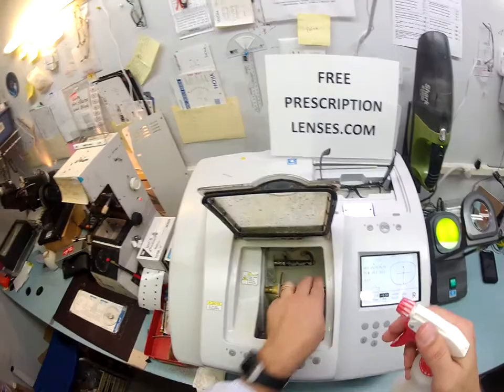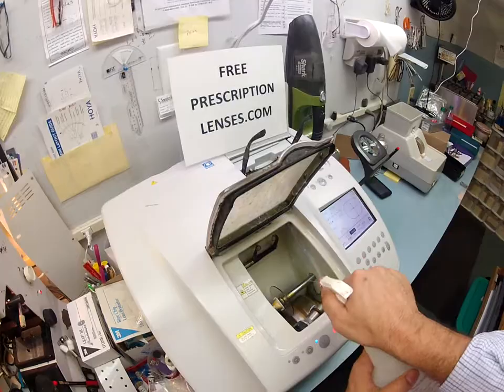So pop this in and hit start. You know, if I knew I had company come over I would have cleaned up the machine here. Let me do that — clean everything up here, make everything look nice and brand new.